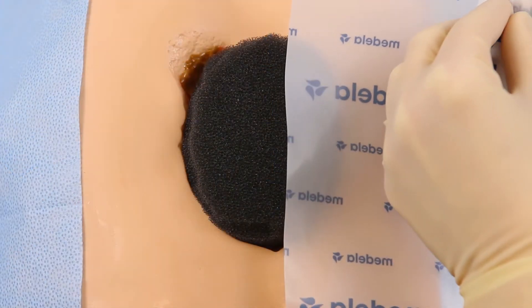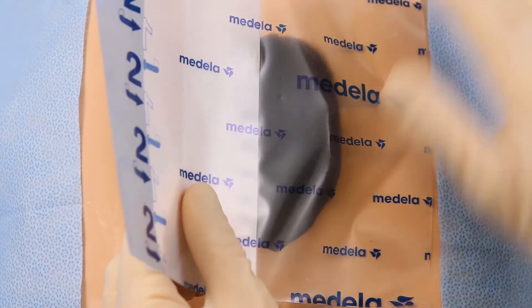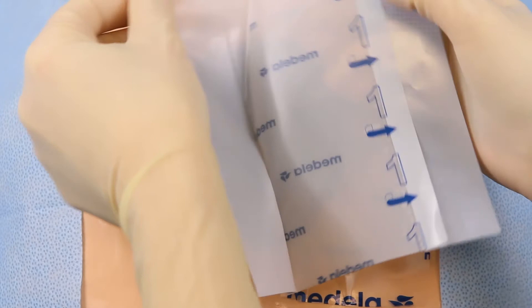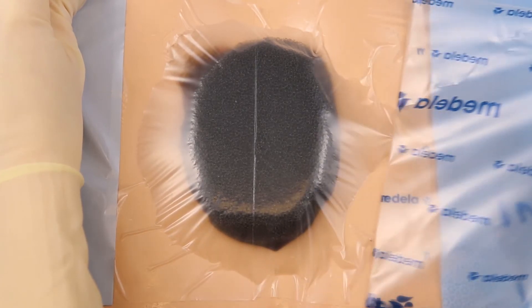Partially peel back one side of layer one and place the adhesive side down over the foam. Do not stretch or pull. Next, remove the remaining side of layer one. Now, remove the transparent top layer labeled 2.